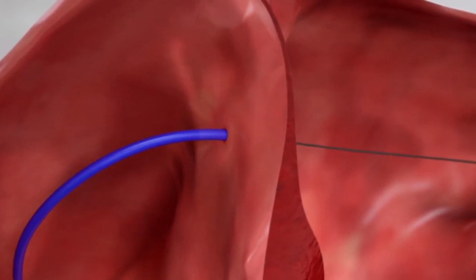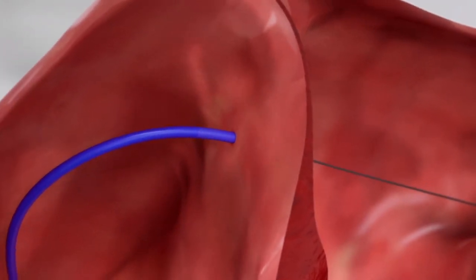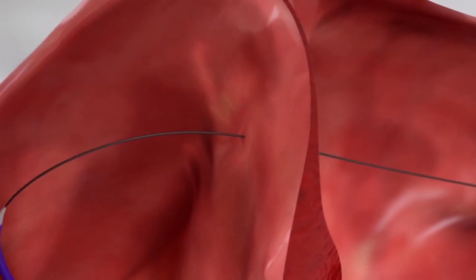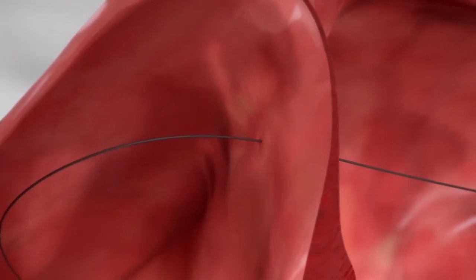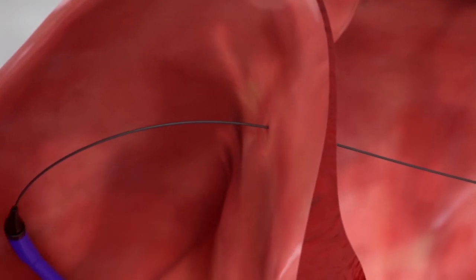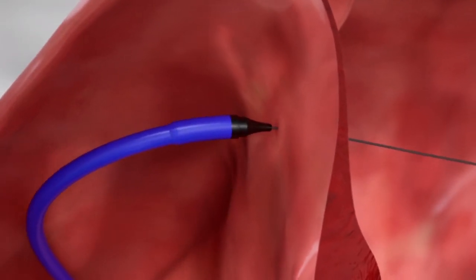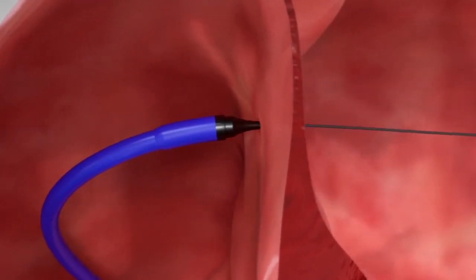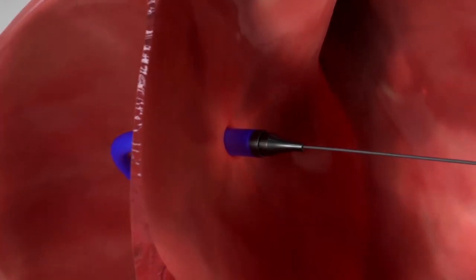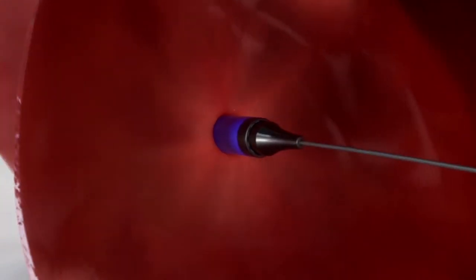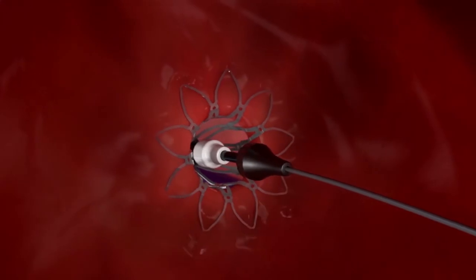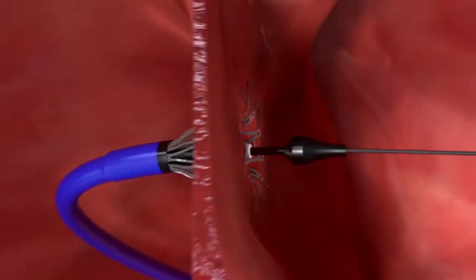The catheter is then withdrawn, leaving only the guide wire in place in the left atrium. The interatrial shunt device is advanced over the guide wire and positioned through the small opening in the heart wall. The implant is then deployed in a controlled stepwise fashion, forming a small passage between the atria.